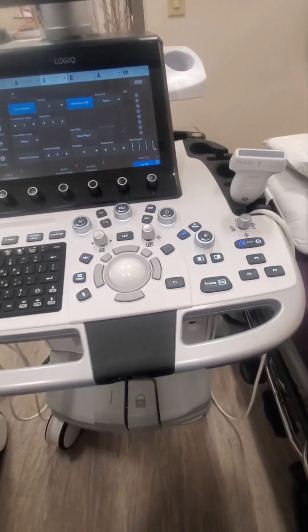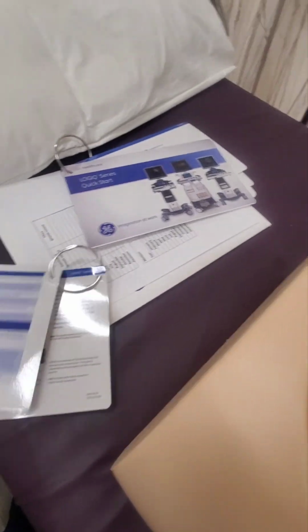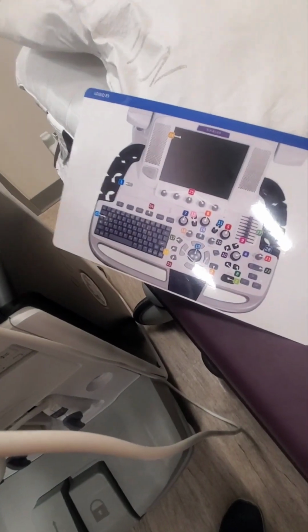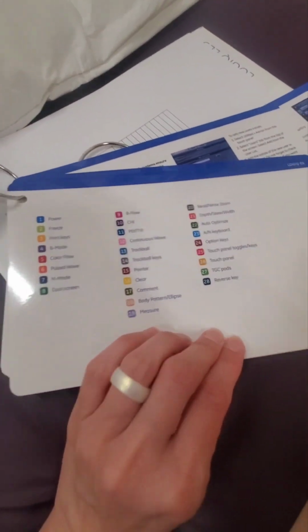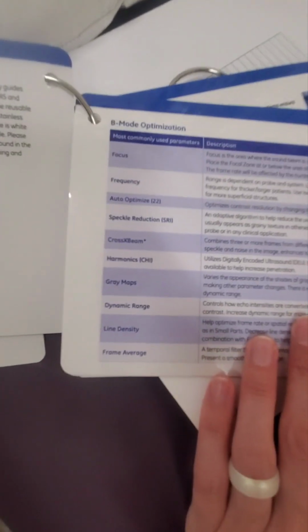In your scanning lab, you have manuals, you have quick starts, you have some information here that gives you tips and tricks and tidbits, okay? Some knobology, the knobs labeled, what each button is. They're pretty much labeled on the machine itself too. Kind of tell you what some of these things do, what's going to happen.